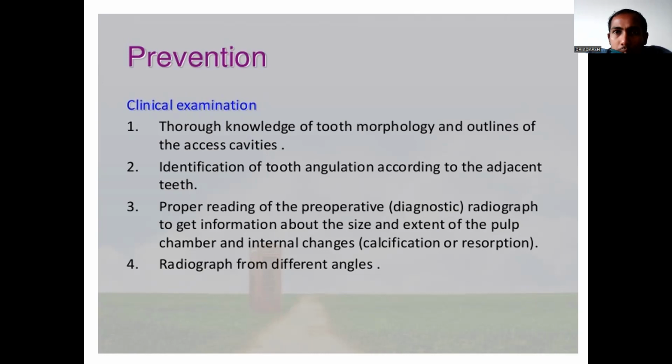If there is no obstruction in the pulp chamber, whenever you penetrate and reach the pulp chamber, you can feel the blood drop. But when the pulp chamber is fully calcified, or when calcific masses are present in the pulp chamber, you may not get a blood drop. So in the case of marking the burr with a marker, the length of penetration is very important.